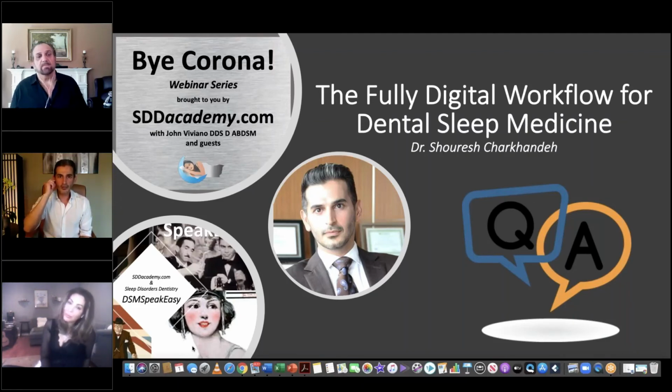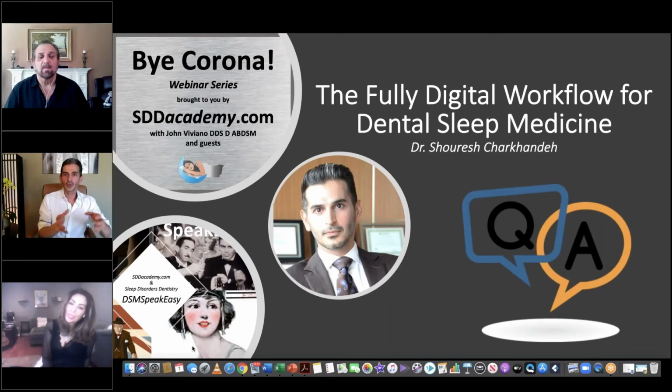Two, we want it to be comfortable in the joint, which we look at their vertical dimension. So if they're vertically collapsed already, we sometimes add more vertical to put them at the proper vertical dimensions to begin with, which is in that 16 to 21 millimeters. You get these people that have a CEJ to CEJ measurement of only 11 millimeters. You have to open that, maybe they have clicking, popping, you want to recapture the disc. So we pay a lot of attention to that. And then we make an appliance there. Otherwise, we try to keep the minimum level of vertical. And then when you get the comfort and efficacy both addressed, of course, it's utilization of the tools to actually get the patient to go ahead with treatment.